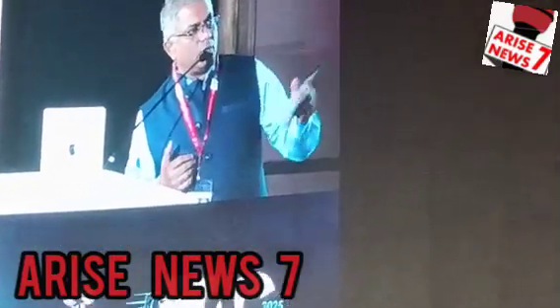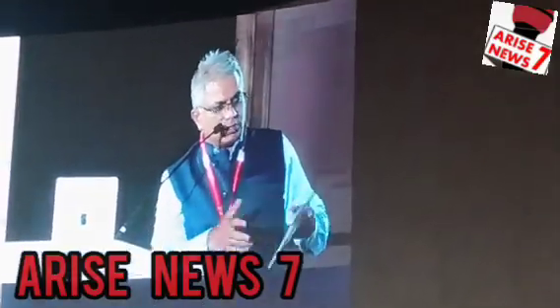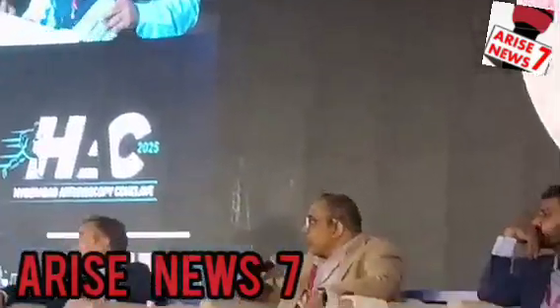So how do you do microfracture? At an angle, or you just do it with a small awl? Awl, always awl. Or K-wire? K-wire. So I also use K-wire, I don't use awl. This was a very old video which has been shown.